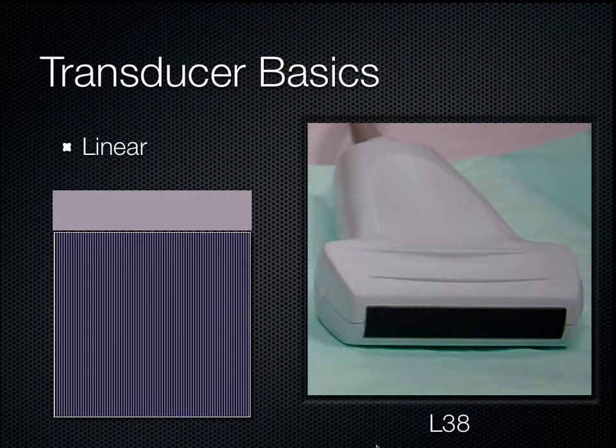This tends to get used quite a bit. Even appendicitis, you can use this transducer in kids and smaller individuals. This would be my go-to transducer for a lot of those bowel things in kids and small individuals, whereas in larger patients, I'm thinking about that C60.